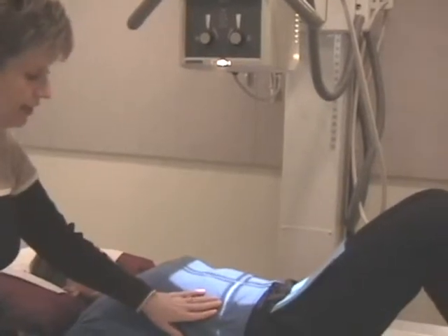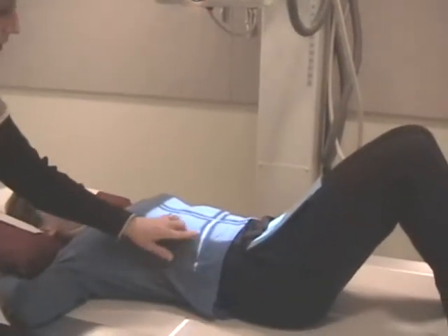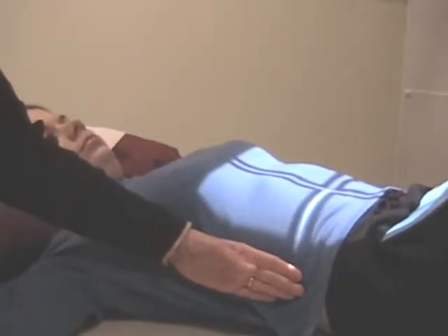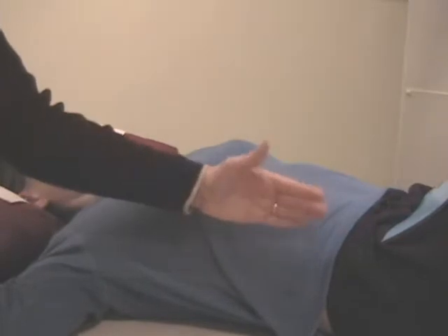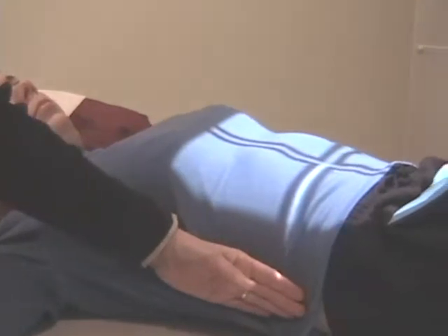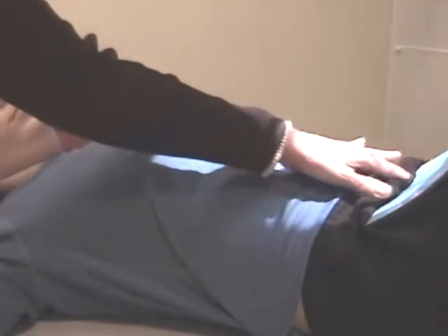I set the collimation up to 10 by 17, but take a look at the light source on the patient now. The light source is right here. It's very close to the lateral portion of her body. If we wanted to include the entire abdominal cavity, all we'd have to do is open it up just a little more on this particular patient. You don't have to have the light skim the body. It just has to be very close to the edge, and we should have the entire rib cage on there in this case. The lead shield is very, very low, and the patient has actually raised her hands up underneath the pillow to help with the demonstration. But this is okay because they're both the same.